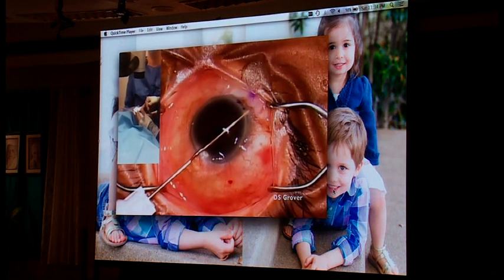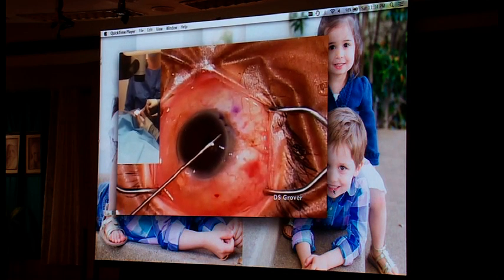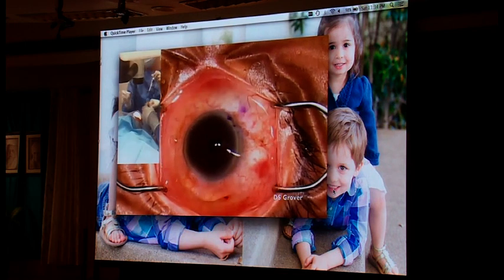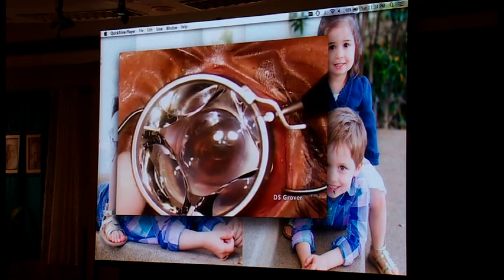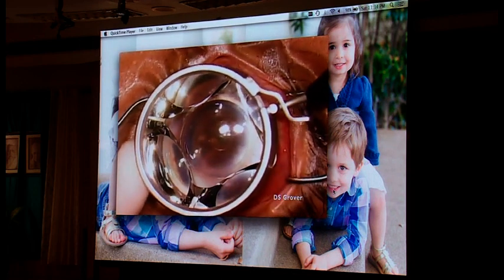If you have any traction or torque on the eye, the minute you disengage the needle from the wall of the eye, you're going to get a flick and you're going to cause damage. That's the most important thing in all these angle surgeries, not just what's going on in these videos, but what's going on with the hands and everything.